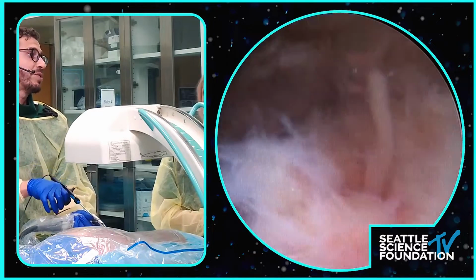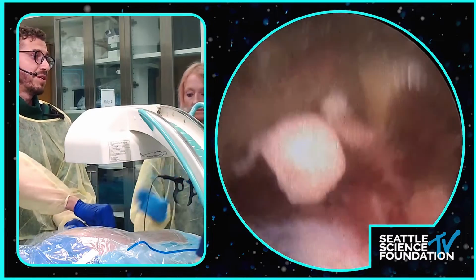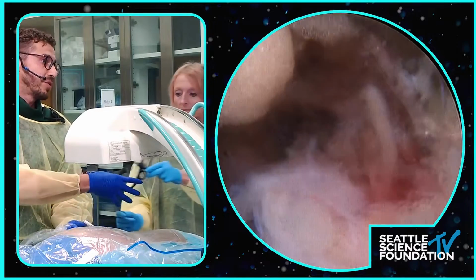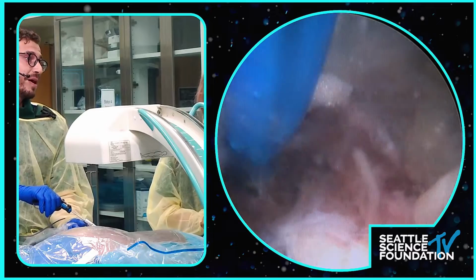So already when you come in here, can you hold this for a second, please? Thank you. I'm going to push this in here a little bit more. So already you're seeing the landmark that we're looking for. I'm going to get this fluffy stuff, which is the fat here, out of the way.